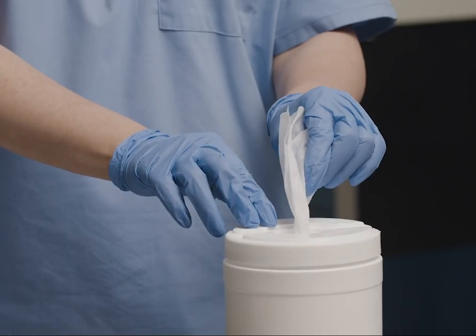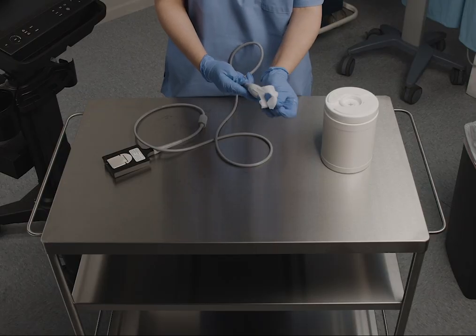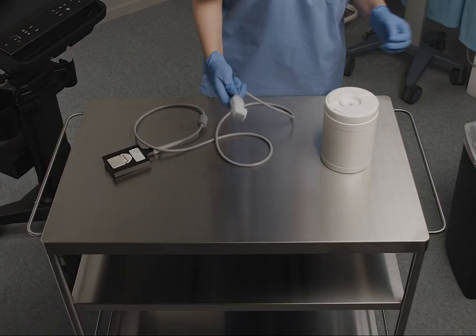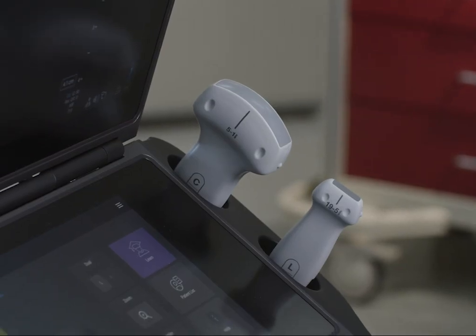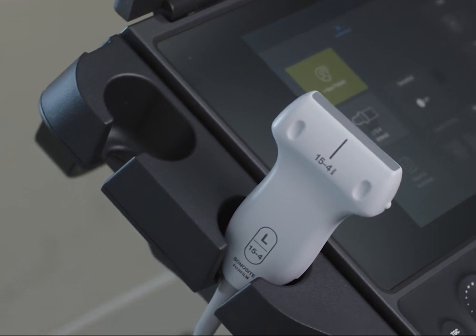Using a pre-moistened wipe, clean the transducer again with the same method. Let the transducer air dry following the chemical manufacturer's requirements for wet contact time. Because the transducer did not come into contact with broken skin or bodily fluids, you are done cleaning and disinfecting it.